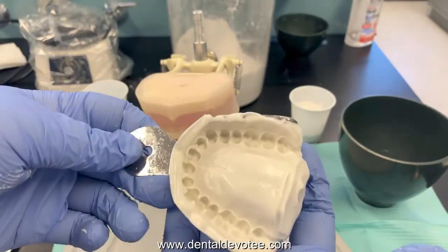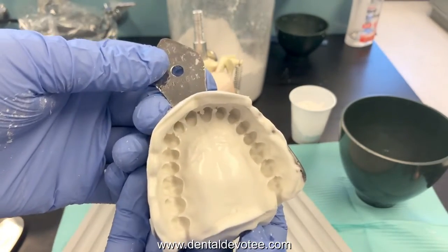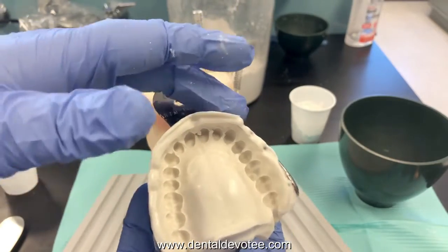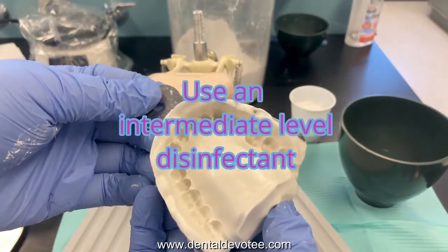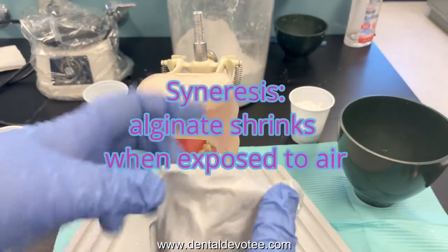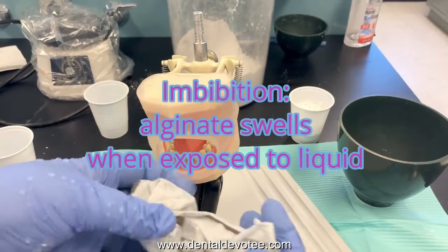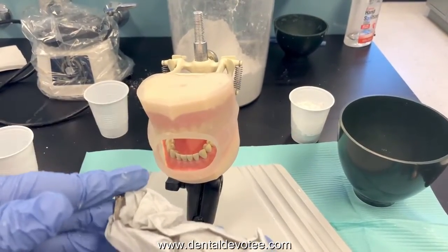Inspect your impression and be able to evaluate it. This would make a nice study model. When it comes out of the patient's mouth, rinse it — you might have a little bit of blood or some food particles you missed in preparation. Rinse it and then disinfect it. Once you rinse and disinfect your impression, wrap it in a moist paper towel. Alginate is moisture sensitive — we need to pour it up within 15 minutes. So by the time you finish with the other impression and dismiss your patient, take these to the lab and pour them up.